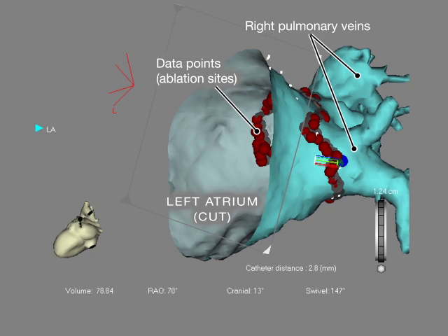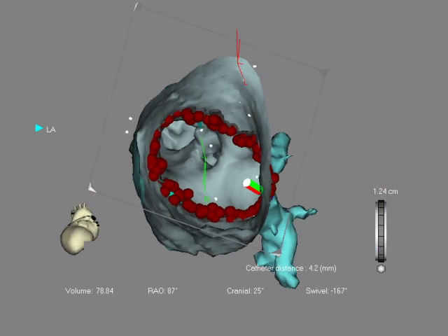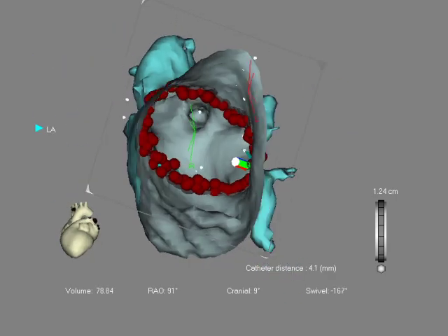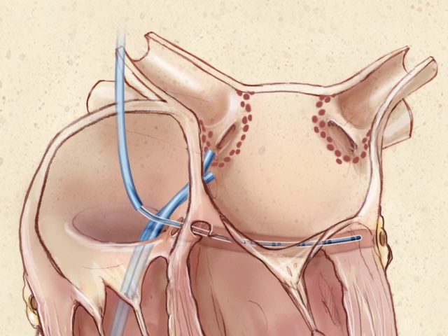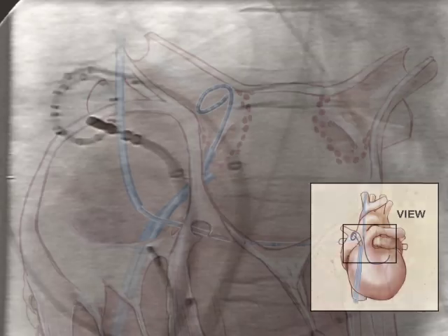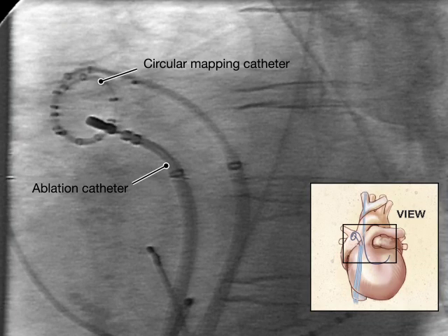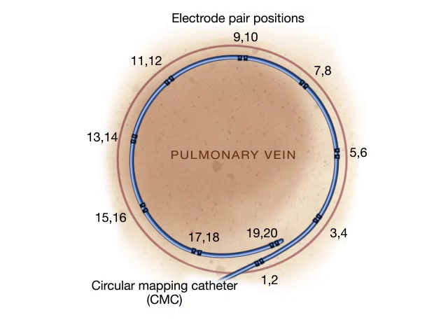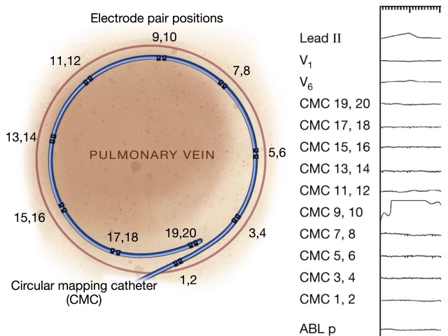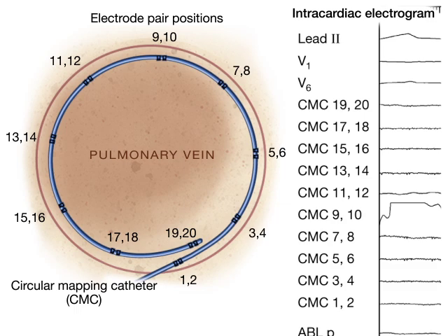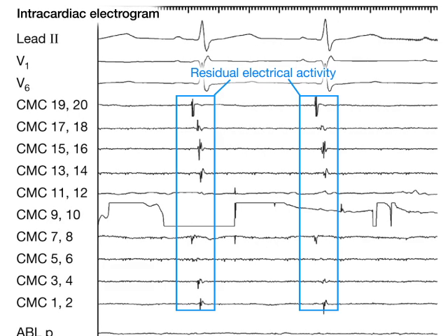Data points are added onto the three-dimensional reconstruction display as the procedure progresses. After the initial ablation circles are completed, the circular mapping catheter is placed sequentially into each of the pulmonary veins to check for electrical isolation. The circular mapping catheter is comprised of electrode pairs that detect electrical activity at specific locations, recorded on an electrogram.